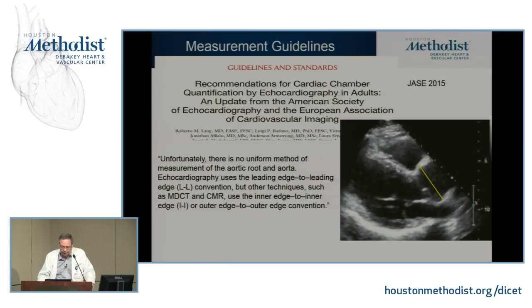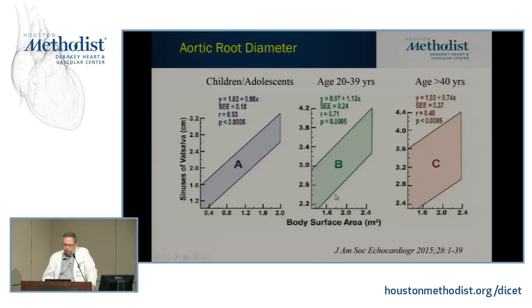And other techniques vary. So in this particular statement, they actually tried to get together for a convention, and they still had the struggle. So even though from an echo point of view, leading edge to leading edge is recommended, I think when we are in our day-to-day practice with aneurysms, I personally like to go all the way out, because that's the one I think we have more agreement. Recognizing, though, that normal measurements will be slightly different, because the measurements that we see in all these documents for normality were done with leading edge to leading edge. And we just have to accept that that's reality today and do the best to deal with it. It's a 1 millimeter difference, but it still could be important at times.